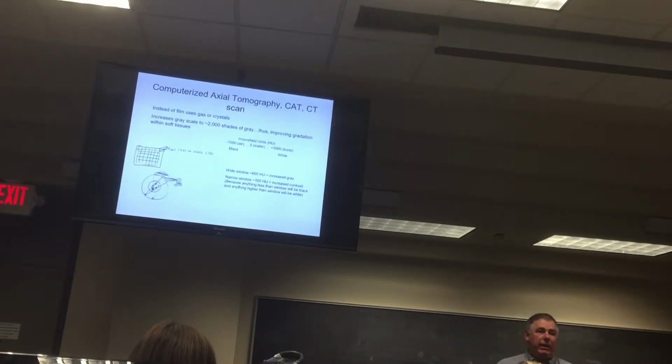When you get CT results back, you're going to see that they refer to, this image was taken with a Hounsfield unit setting of 236. So that's what a Hounsfield unit is. You don't have to tell them how many Hounsfield units to shoot it at. They will do that themselves. But that's what it means when you see that.